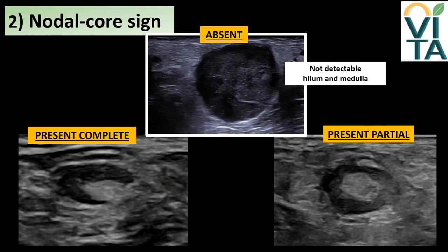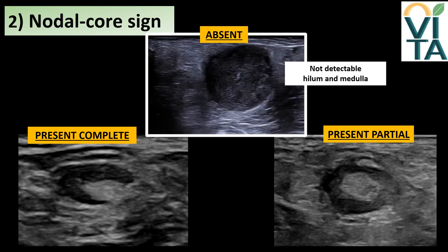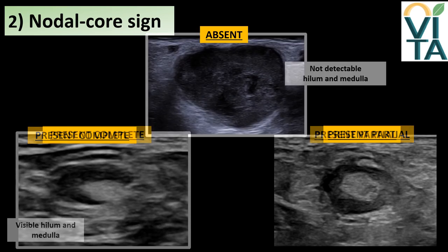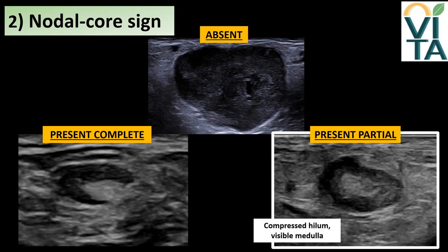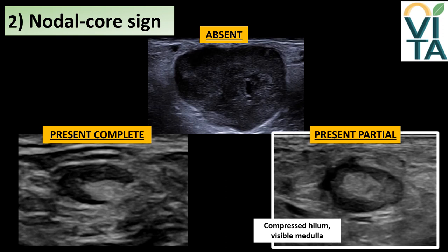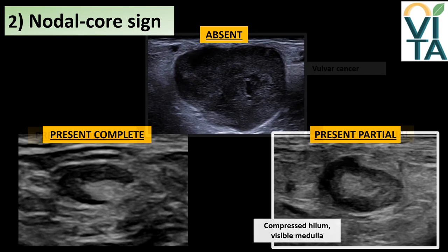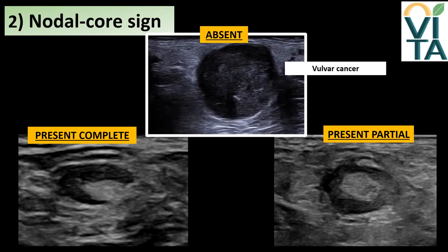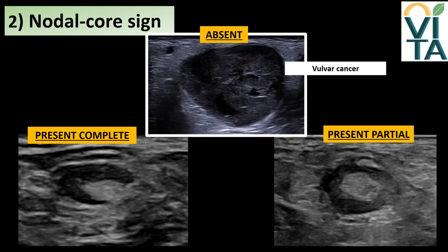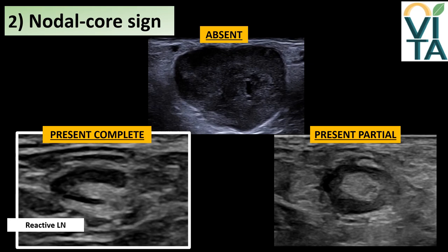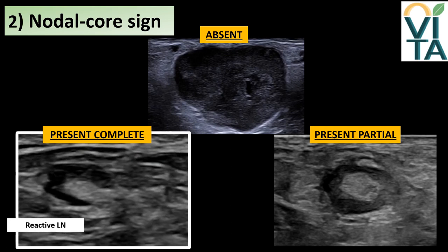In the video above, neither the hilum nor the medulla can be detected, so the nodal core sign is defined as absent. Below on the left, the complete hyperechogenic medulla and hilum are clearly visible, so the nodal core sign is present and complete. In the lymph node on the right, the hilum cannot be seen but the medulla is recognizable, thus the nodal core sign is present and partial. The loss of normal architecture in the first lymph node is the result of complete metastatic involvement from vulvar cancer, while the two lymph nodes with present nodal core sign are normal.